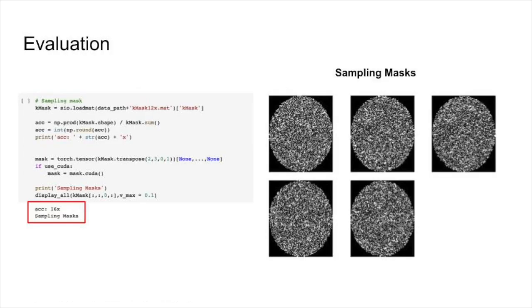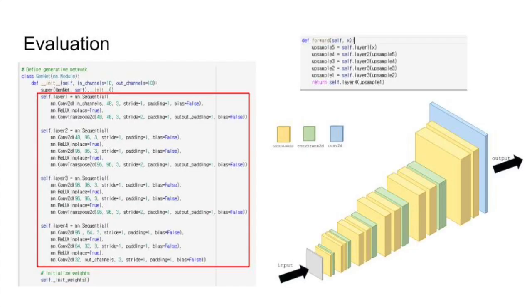To find out the reconstruction performance of the proposed method, we conducted an experiment. MRI obtains data from frequency, and our method only measures the frequency 1/16 to shorten the MRI acquisition time. In this masked image, white spots correspond to the obtained frequency, and the black spots are the unobtained region. First, the initial image is created with the measured frequency using the SENSE technique, and each 5 images are taken at different times. The structure of the proposed method is as follows.